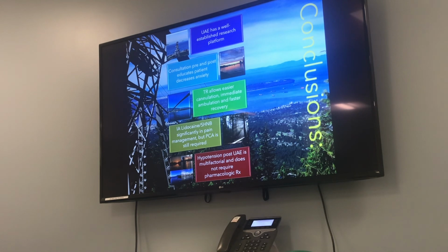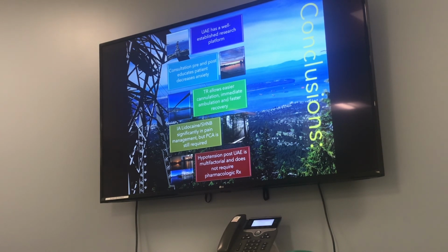We've had patients who have delivered part of it and then they actually see the particles in the fibroid that we've injected, because the 700 to 900 micron particles you can see with the naked eye. And some of the manufacturers color their particles. So each different particle size is a different color. So then they look at it, they see all these different color particles. It's really funky.